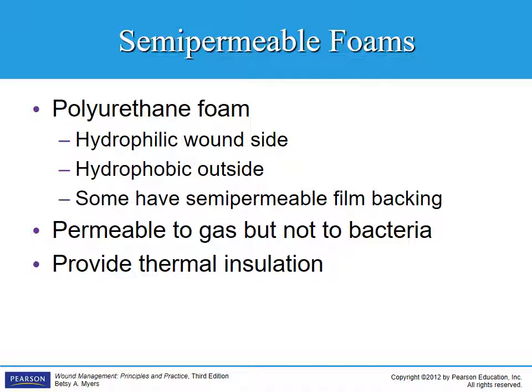Semi-permeable foam. So there's a couple of types of semi-permeable foams. Polyurethane foam is hydrophilic on the wound side, meaning it will absorb fluids on the wound side. Hydrophobic on the outside.